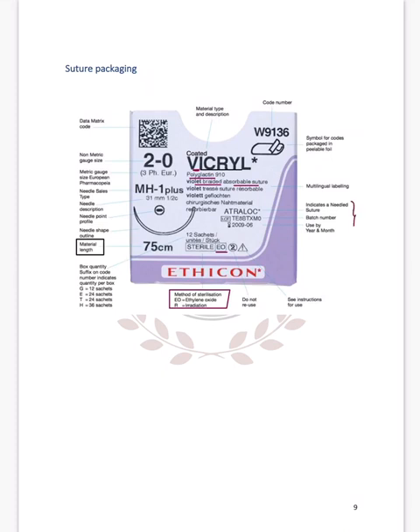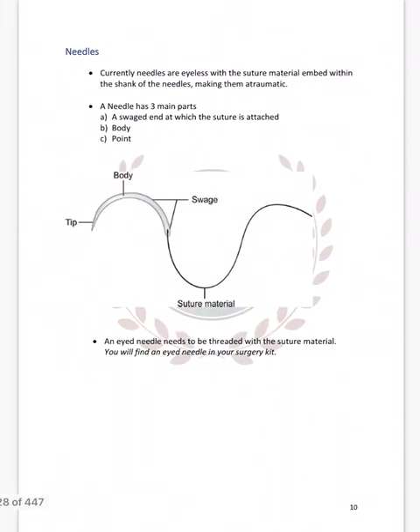Okay, so this is basically the batch number used, how and where you can use it, guys. Not so important. So this is the important information that you get on a suture packaging.